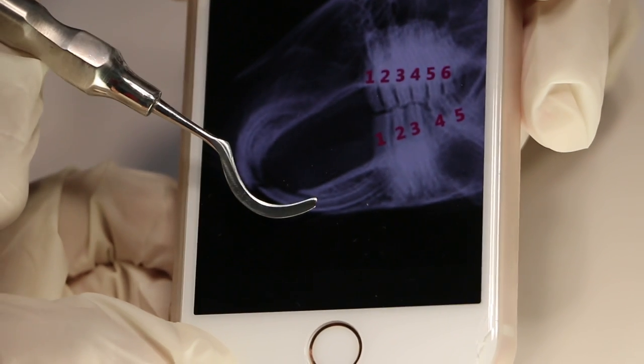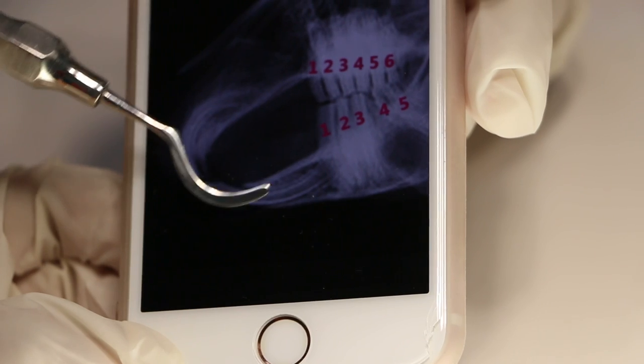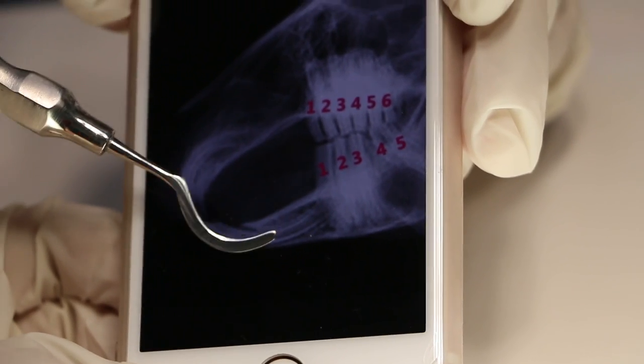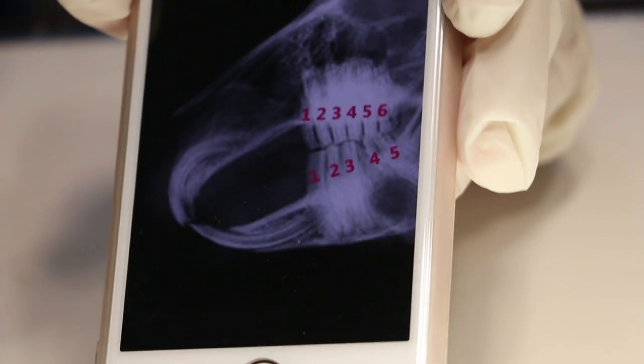And then the other side — this is for the lower incisor. You can see that it curves and goes in to facilitate the extraction of the lower tooth.